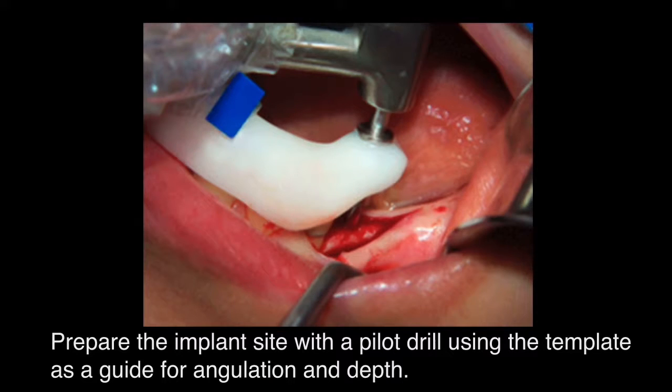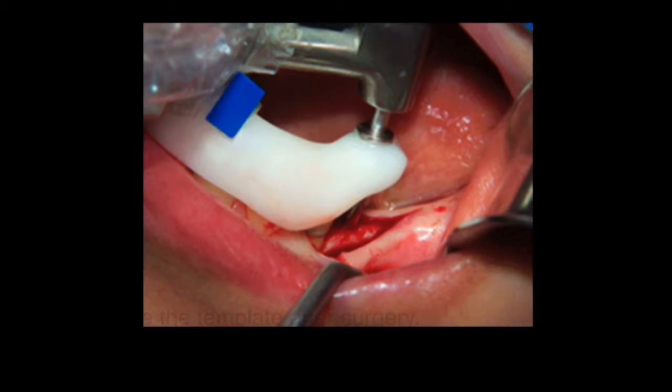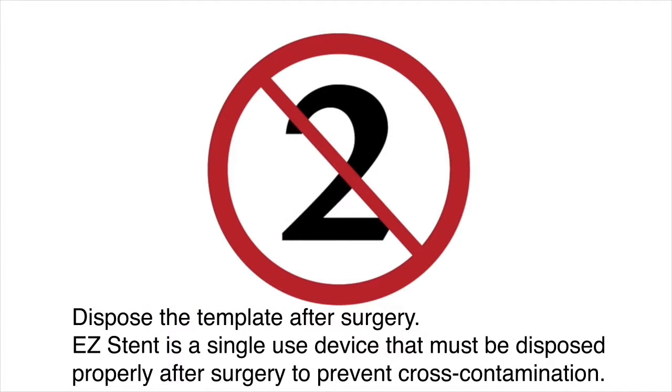Prepare the implant sites with a pilot drill using the template as a guide for angulation and depth. Dispose of the template after surgery. EasyStent is a single-use device that must be disposed of properly after surgery to prevent cross-contamination.